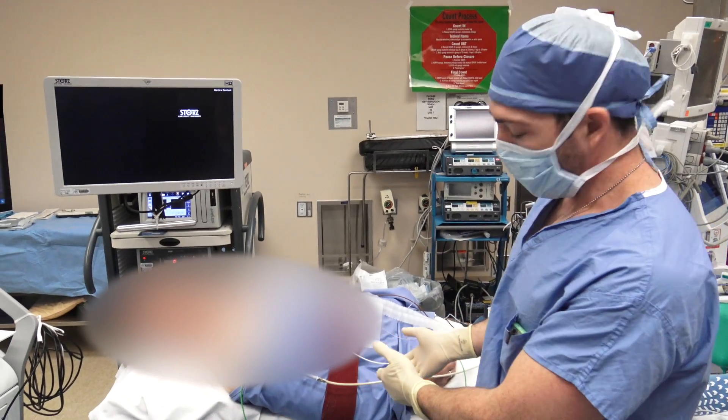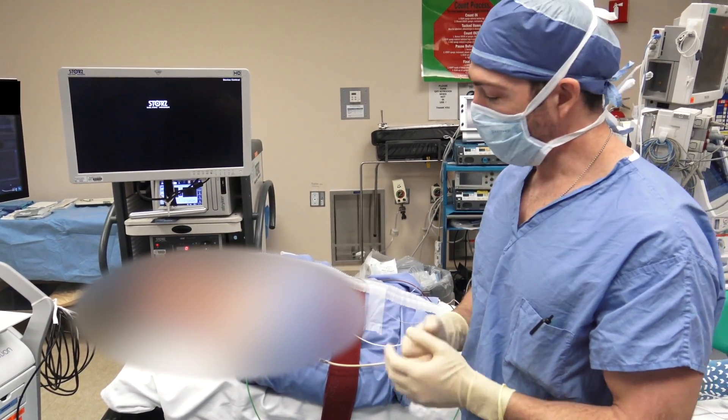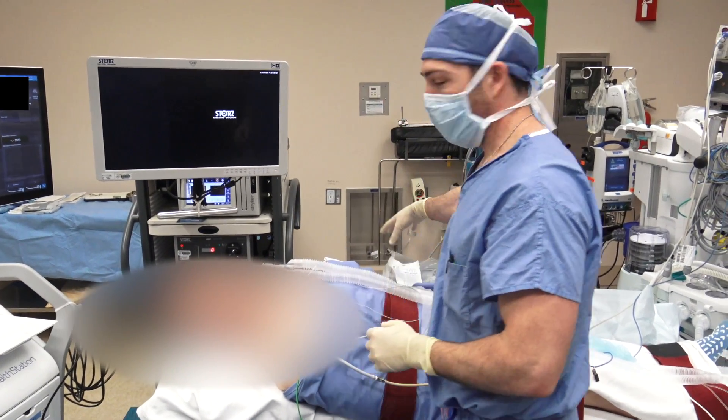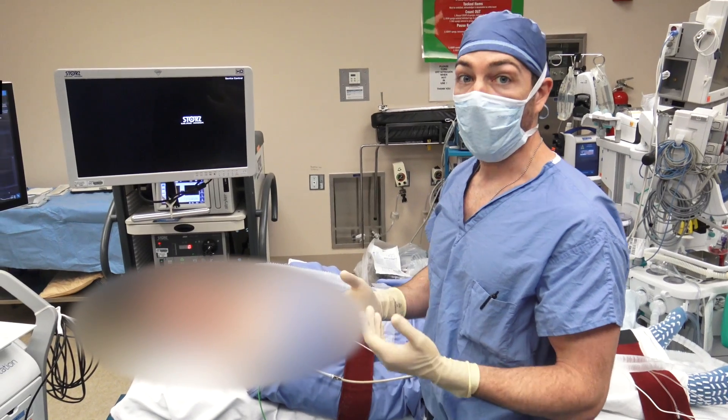We typically tuck the right arm, as you can see here. Most of us are right-handed surgeons. Even if you're left-handed, we still typically operate from the patient's right side. Having this arm tucked will allow you to flex the patient. Usually the left arm is out in case any work needs to be done from the anesthesia standpoint with IVs, etc.